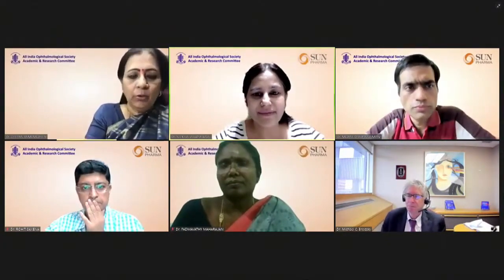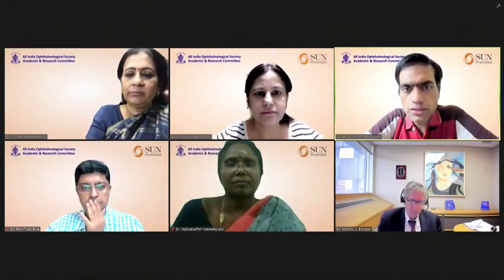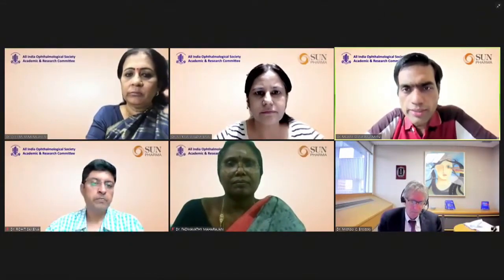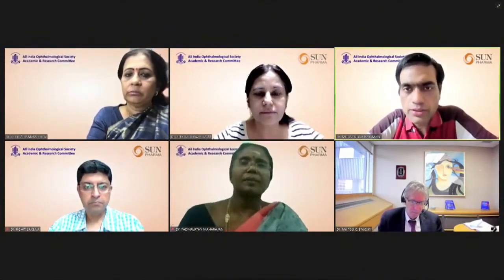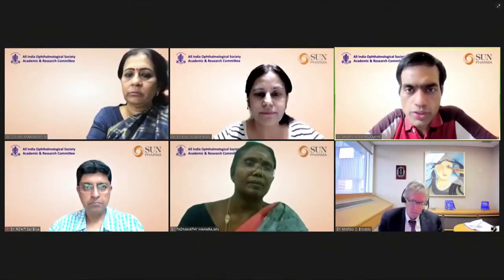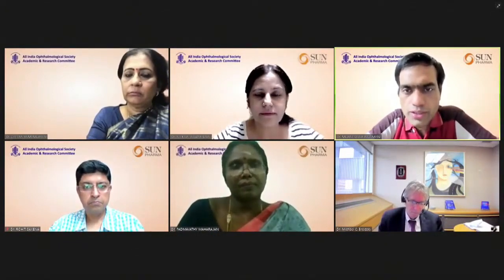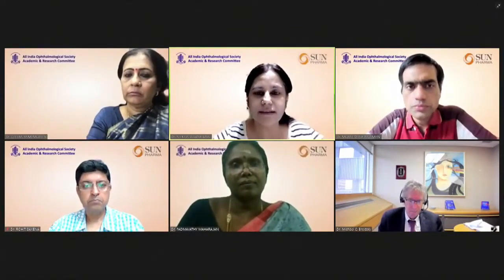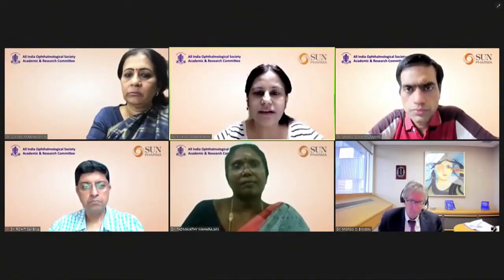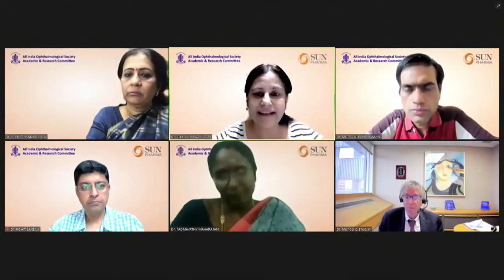Murli, you have anything to ask? The appearance of optic disc drusen, Shikha. Does it depend on the stage of the drusen? Like only after calcium deposition, the hypodense area with hyperdense crenated margins comes on. Is that true? The stage of the optic disc drusen will determine the appearance on OCT. Yes, that's what, Murli, the consortium has defined the optic disc drusen as a hyporeflective echo surrounded by a hyperreflective crenated margin. That is the description of a calcified drusen.